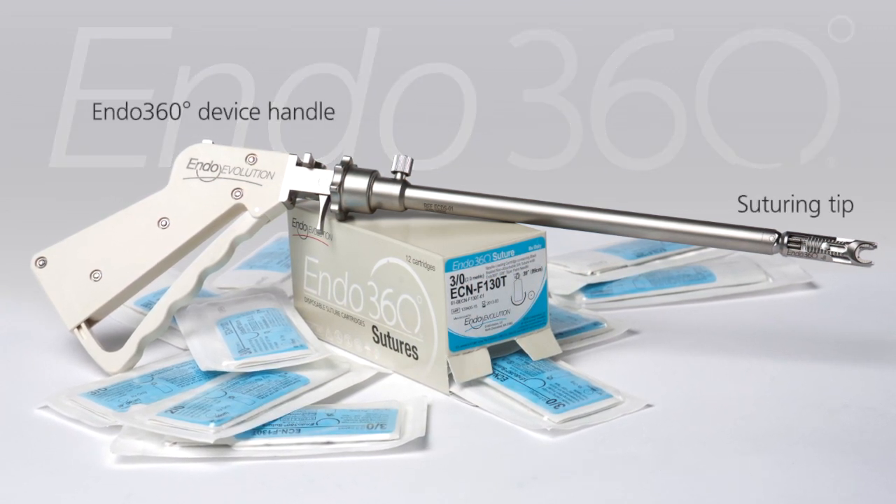The handle of the Endo360 device is connected to the device shaft, at the end of which is located the suturing tip.